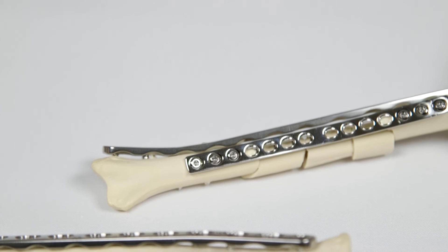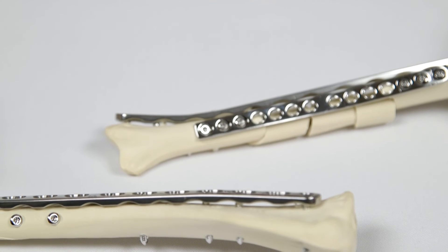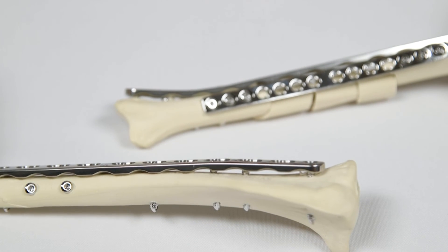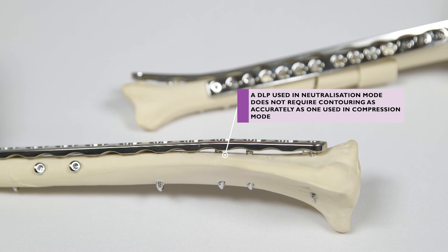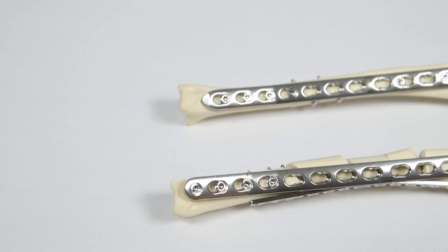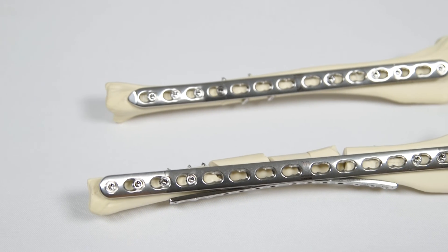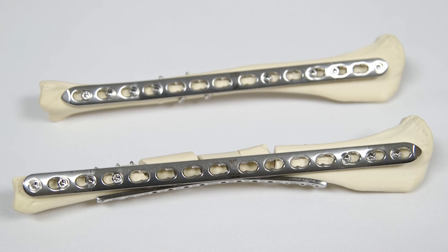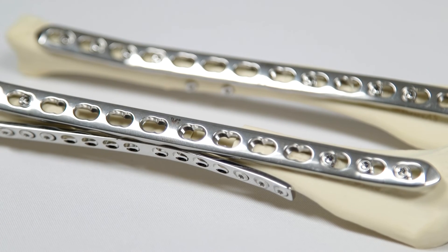A DLP used in locking mode as a neutralisation or bridging plate does not need to be contoured as accurately as a plate being used to achieve axial compression. This can save time during surgery, as accurate plate contouring can be a time consuming process. It is also beneficial for fracture healing as soft tissue and periosteum can be left intact beneath the plate, and it also allows DLPs to be applied using minimally invasive surgical techniques.